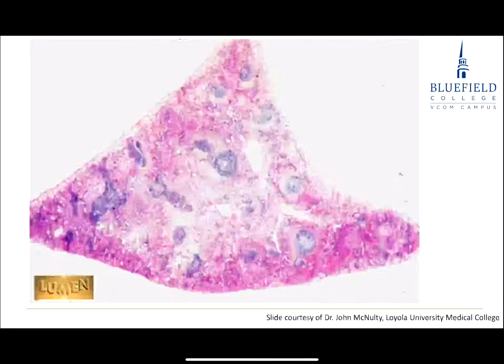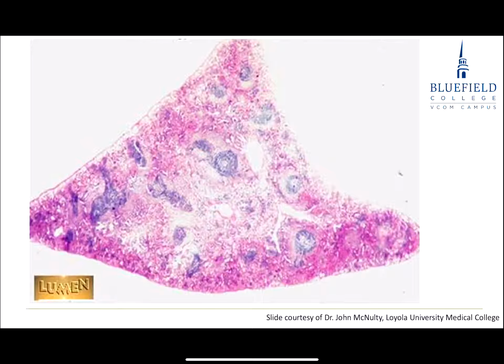The nodules are the white pulp. Everything else in there is the red pulp. Okay, questions? Can you help us point out, are these all lymphoid nodules or any of them? Right in here, on this slide, this is a very low amount of pigmentation, so all of these dark staining structures here are lymphatic nodules. All of those are white pulp if we're using that, that's the white pulp of the spleen.